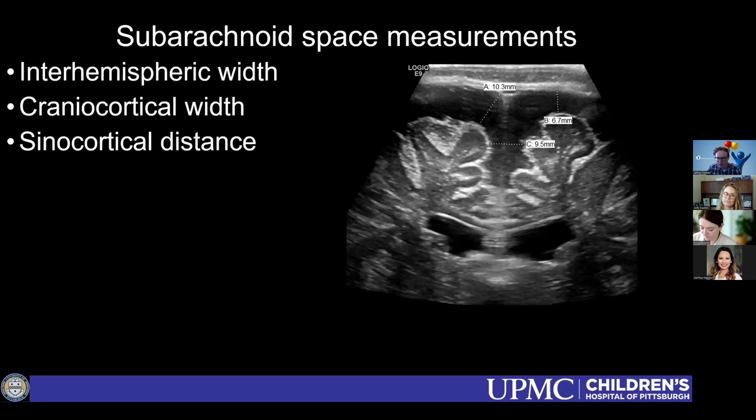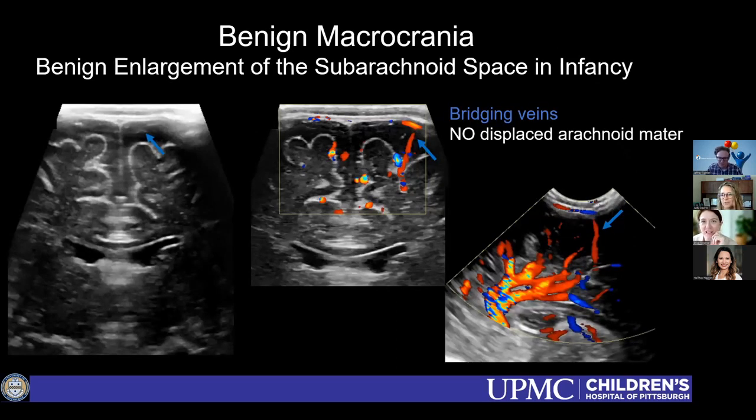And I think that's probably due to higher resolution. And like you're saying, for this particular topic, the extraaxial spaces, if you look back at those actual papers where they did these measurements, the image quality is nothing like we have now. So it's definitely a point where I think we just don't have great data for it yet.